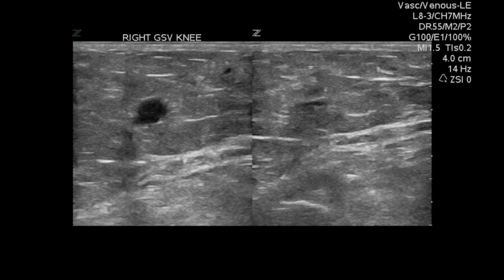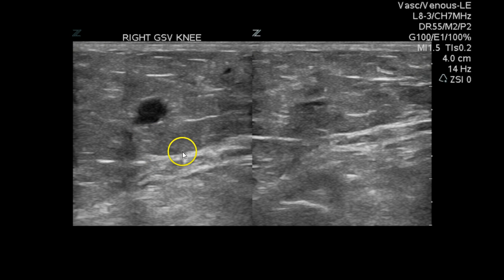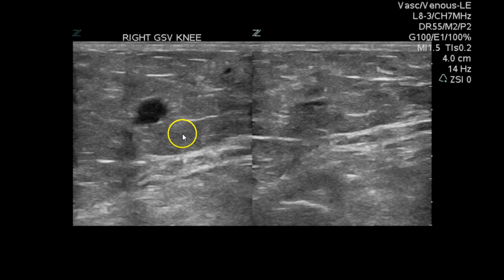We look at the great saphenous at the knee, and we can see that this vein fully compresses. However, I question that this is actually the great saphenous, because when you look at the line here — which would be the fascial plane — you can see this is in the superficial tissue. So I'm not quite sure if this is actually the great saphenous, but maybe a tributary. Regardless, it is fully compressible.